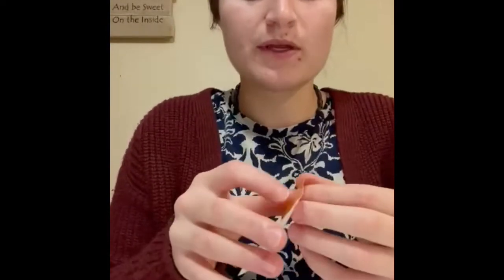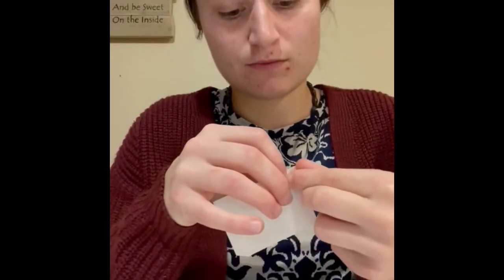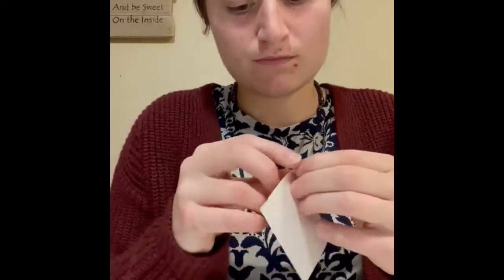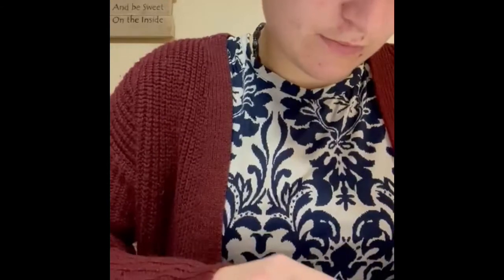And then the expiry date would be 24 hours later, so October 2, 2021 at 7:30. Not sure if you can see that. So this label will then be put onto my bag. Like this.